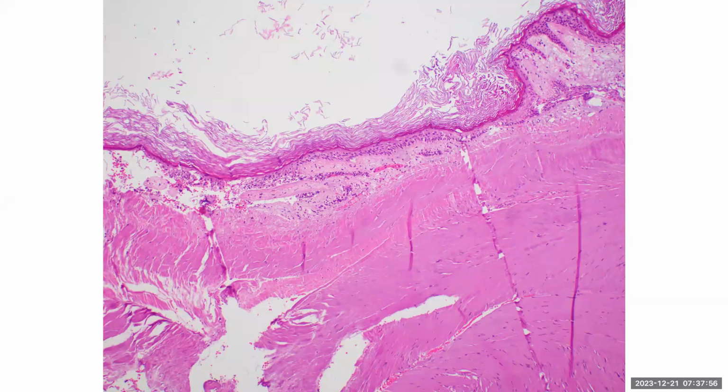So we're talking about one of those cystic benign lesions, and then the pink area at the bottom is all connective tissue, etc. So from right off the bat, this looks like an epidermoid cyst because of the squamous epithelium, the dry keratin in the lumen, and I don't immediately see any adnexal structures. If I see them, then I call it dermoid cyst instead of epidermoid. Next.